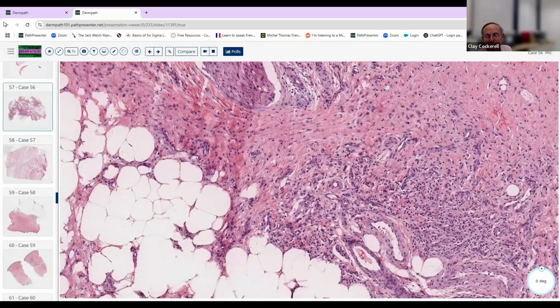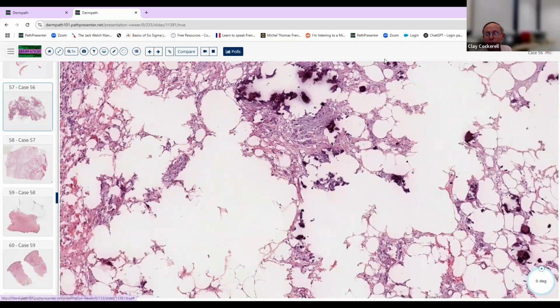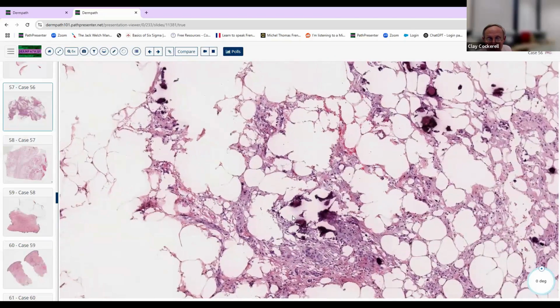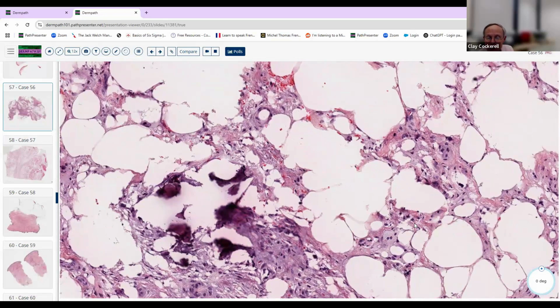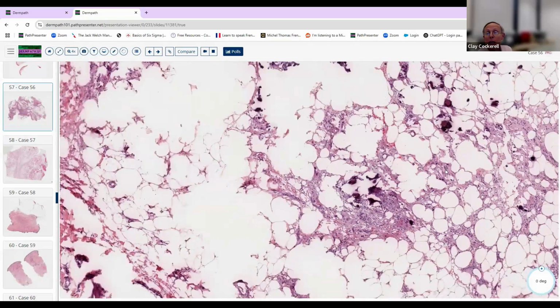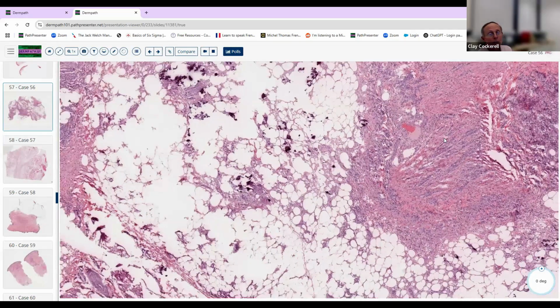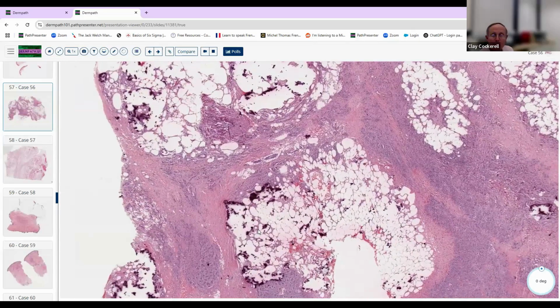This is calciphylaxis. Calciphylaxis, not just dystrophic calcification. That usually gives you large aggregations of calcium. But when you start getting these small stippled areas of calcium in the fat, like you see here, it's virtually pathognomonic for calciphylaxis. If you get secondary calcification of blood vessels with overlying thrombosis and destruction and necrosis of the overlying epidermis, degeneration of collagen, it's basically nothing else will do that. So calciphylaxis, remember this, it's not just incidental calcification.